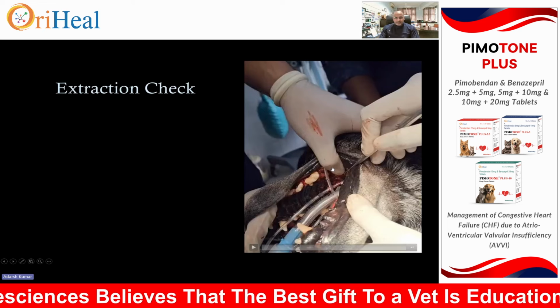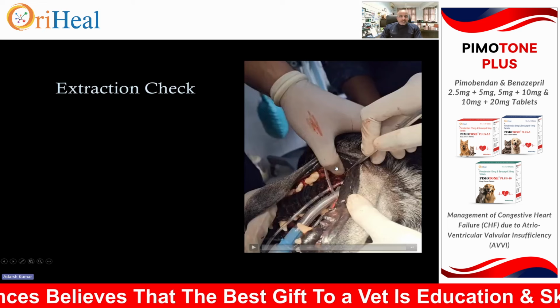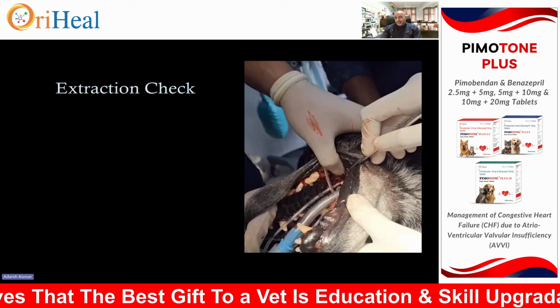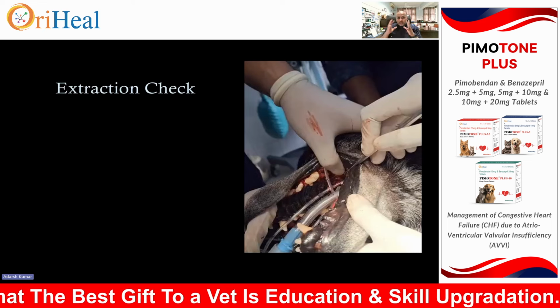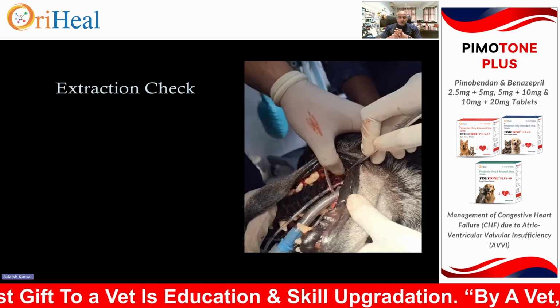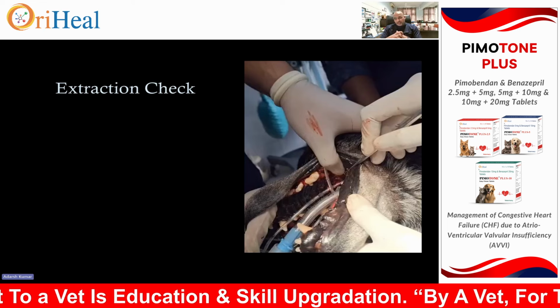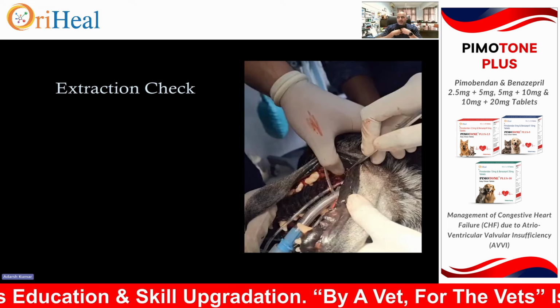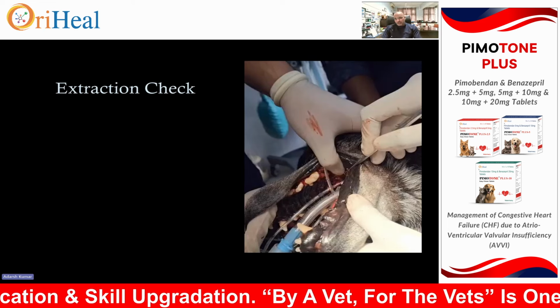Now, once the tooth is extracted, how do you know that you have taken the full tooth out or that part of the root has remained inside? Because sometimes due to undue pressure, it happens with me also. Sometimes the tip of the root remains inside, then it has to be taken out.